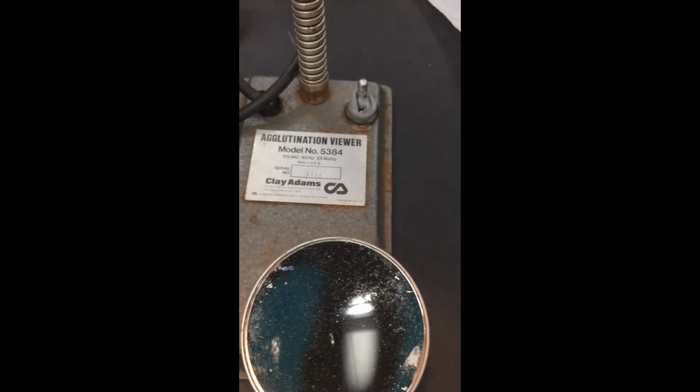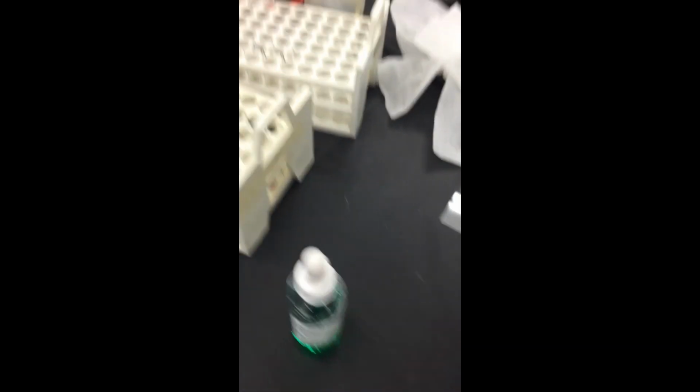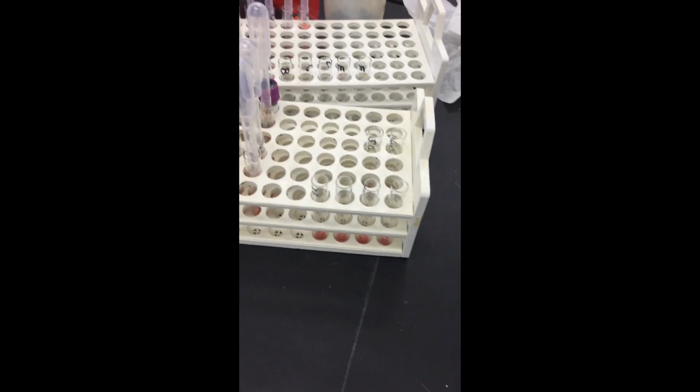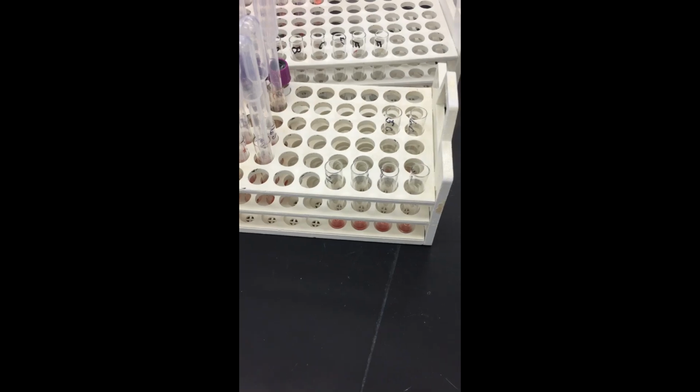So after doing that with the IAT, we need to read each one of the tubes that we thought was negative. We need to read it microscopically. I'll set that up now. Trying to take a video of tube 1. You can see the cells really just floating by and not, as Kat described, holding hands.